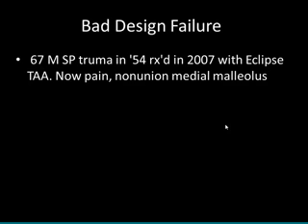So I don't know that that's the best way to do it. I used it on somebody else who had a STAR ankle replacement, and there was complete dissolving of the calcium phosphate back into solution, and I ended up having to come back and put cement in. So I reviewed the world's literature on the use of cement and calcium phosphate. The answer is we don't know quite what to do with these cysts.